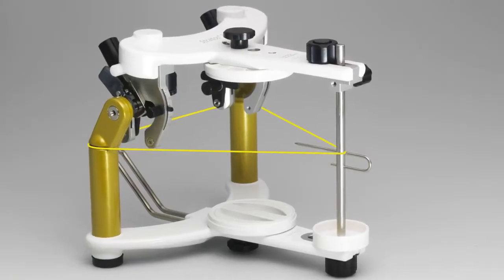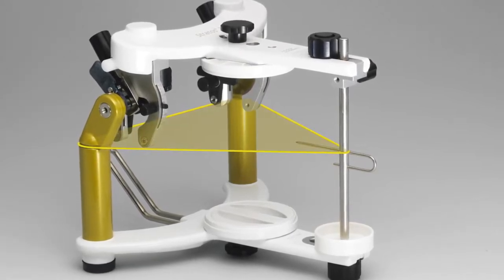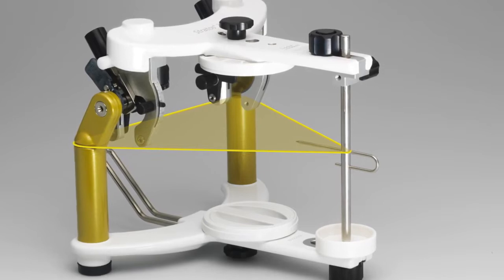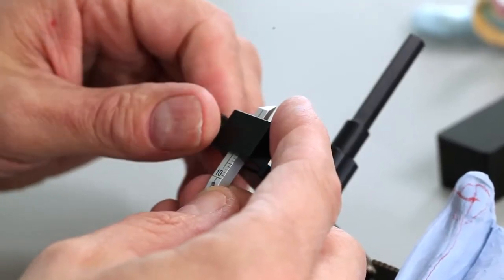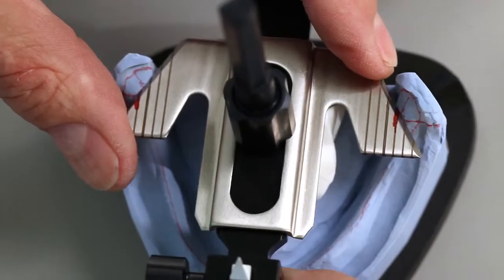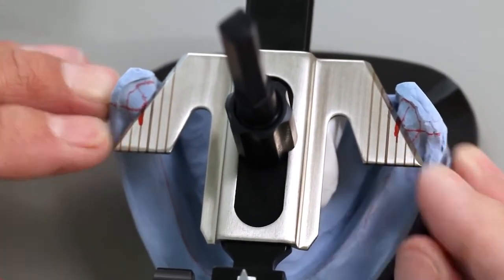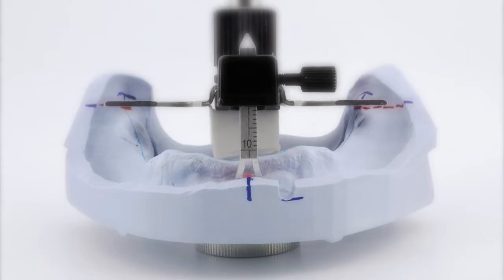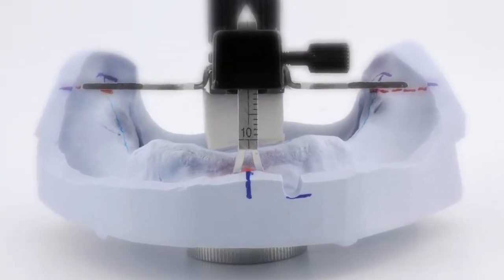The horizontal guide supports the average value model orientation of fully and partially edentate or edentulous models within the Bonwell triangle of the articulator. Set the symphysis fork of the horizontal guide to half the intervestibular distance. Make sure that the side wings are aligned bilateral to the half of the retromolar pad. The fork sits on the lowest point of the mucolabial fold, oriented according to the midline.